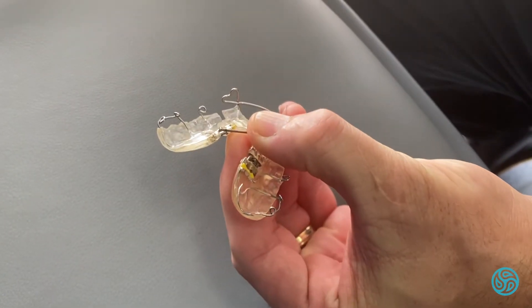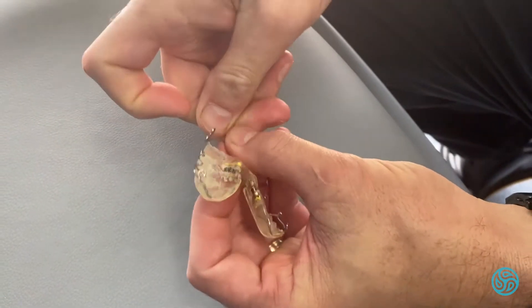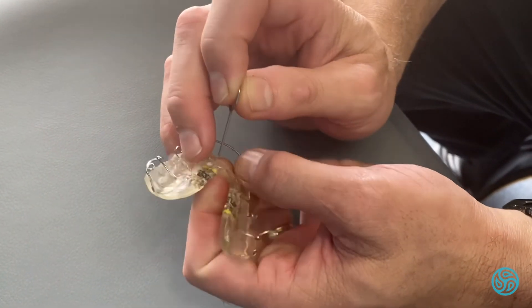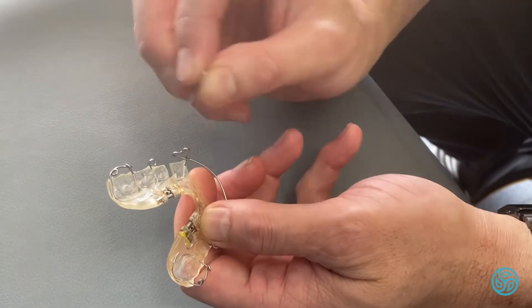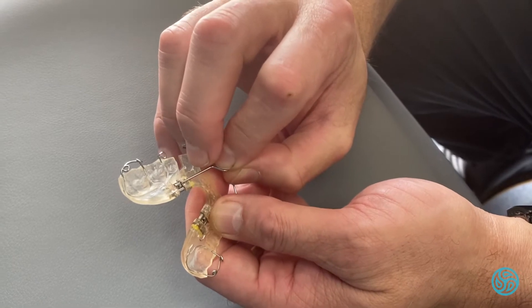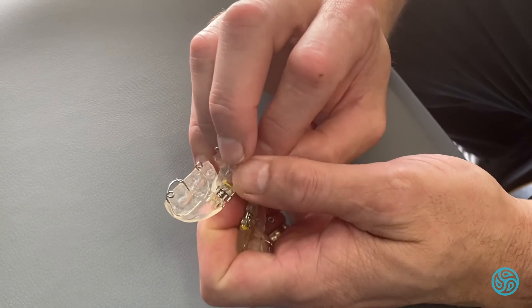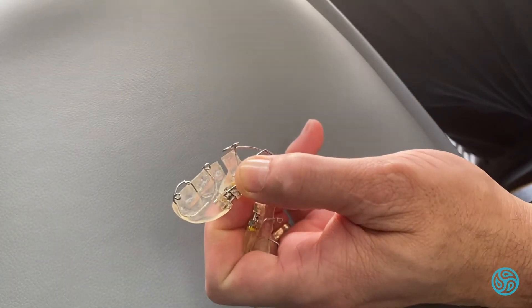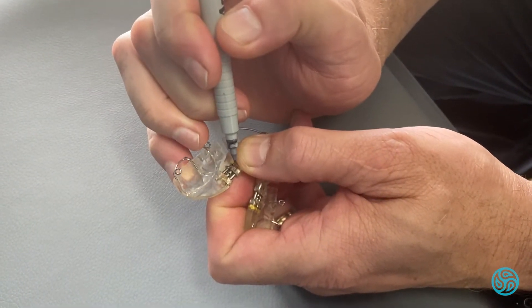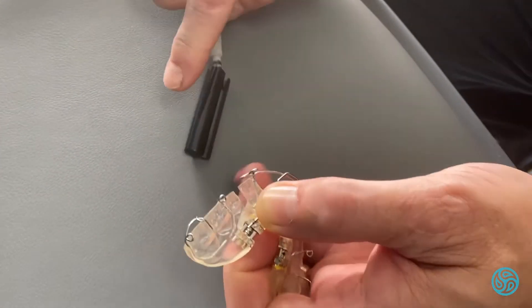For every turn from extremity to extremity is 0.25 of a millimeter, so four of these turns will give us a millimeter. What I'm after is that little gap opening up a whole millimeter in two weeks' time. If we turn it twice a week — Wednesdays and Sundays — for two weeks, we'll end up with a mark a millimeter further along.